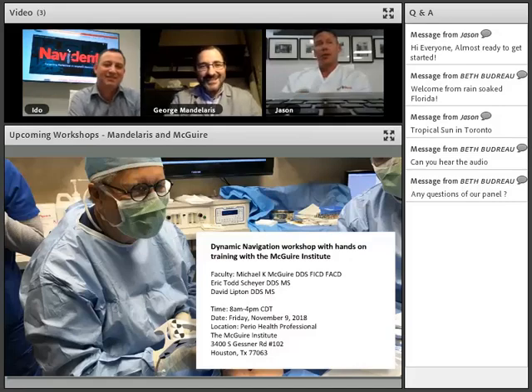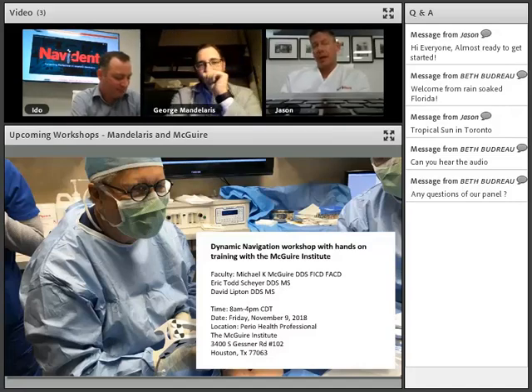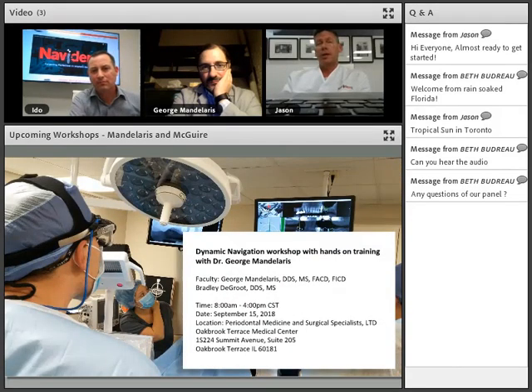You can do 4, you can do 5, you can do 6, but you can do 3, because what we determined, Arish, our main developer, has been doing a lot of testing with the old stent and fiducial versus the new trace registration. And when we do 3 points in trace registration, our accuracy is 0.4 millimeters, which is basically the limit of the camera, the limit of the system. And with the fiducial, consistently it was 0.52, 0.53. So we've drastically increased, and that's with doing 3 points on the tracers.